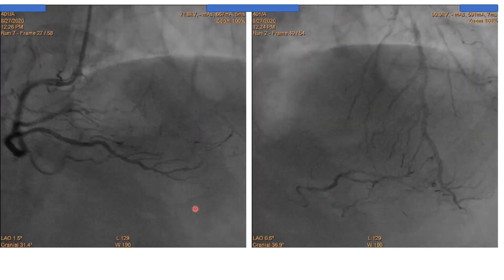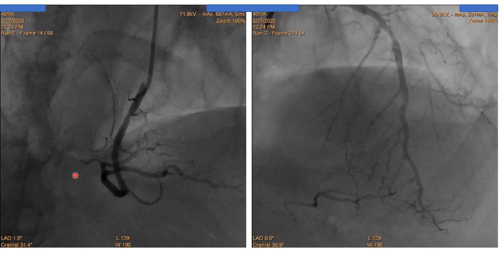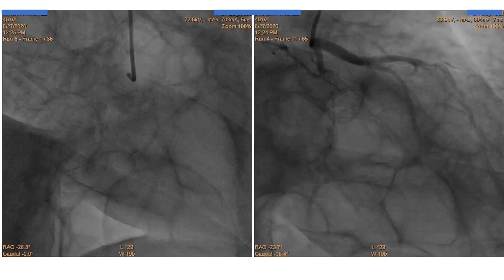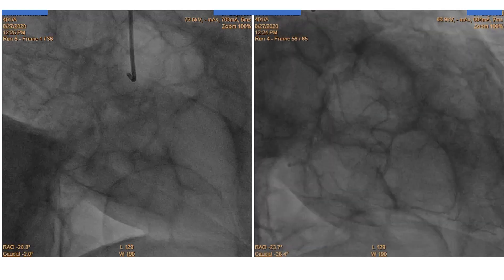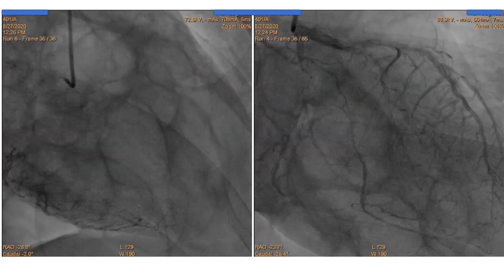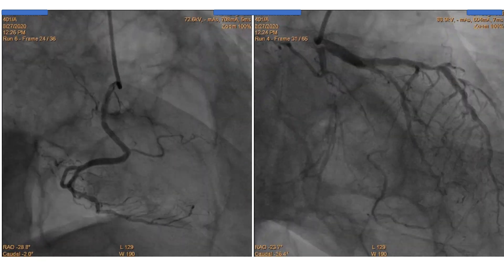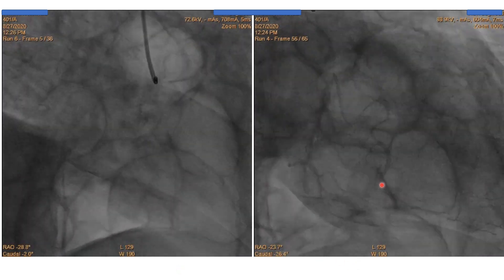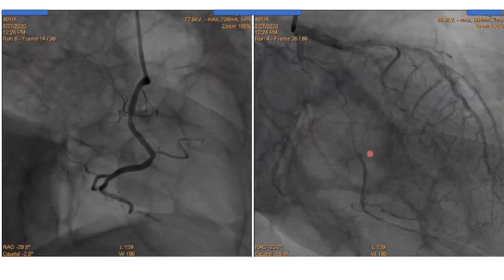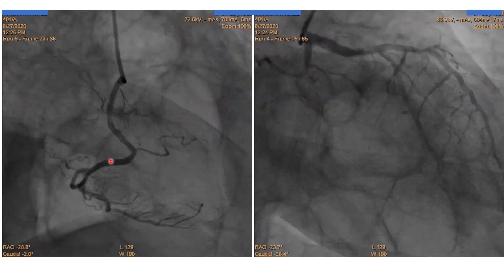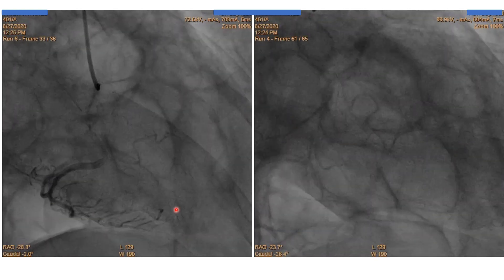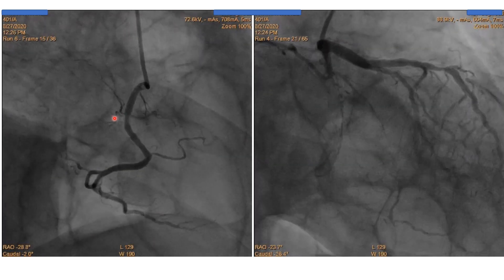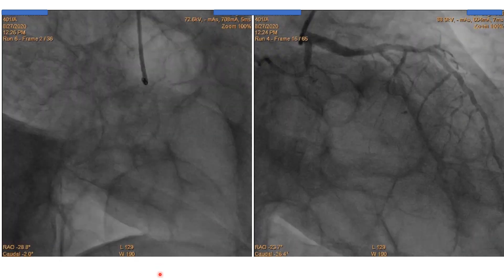The RAO view of both injections — the left and the right system — proves that the vessel is most likely an RV branch that is totally occluded. So this is the left system, and this is the vessel we are talking about. If we see the RCA, there is no big RV branch, and the course of that vessel is coming here. Most likely, the ostium or the total occlusion is at the site of this plaque, and there is no stent in it.